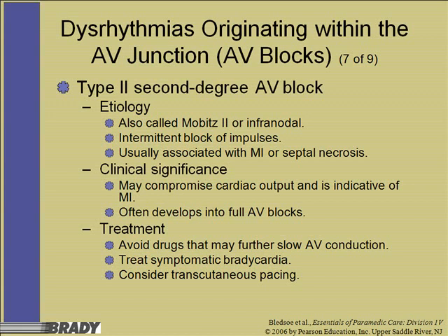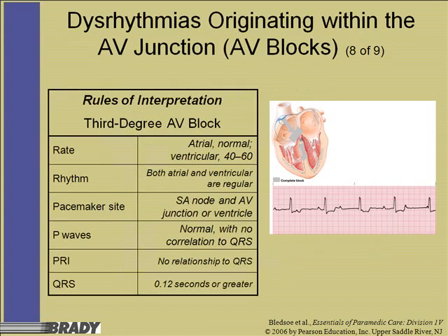So now we've learned how to defibrillate the patient. In other words, stop all cardiac activity. We've talked about synchronized cardioversion, where we apply a set amount of electrical activity to knock out a dysrhythmia, and then we're actually using the monitor to electrically stimulate the heart to beat. So now we've got three tools, or three uses of that cardiac monitor that y'all have been introduced to now.